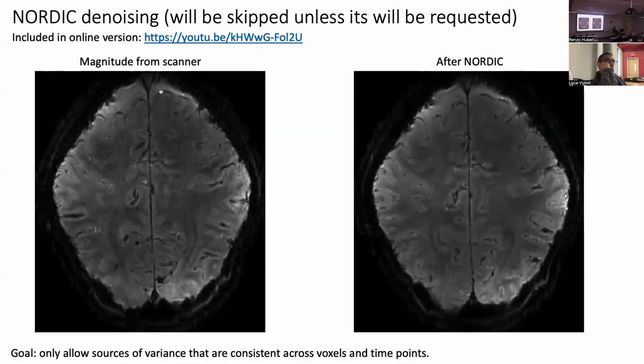Nordic is the first step that is included in the online version of this tutorial that I recorded last week. So if you will not get to it tomorrow, you can check it online. It's basically converting data time series that look like that into data time series that look like that. And I'm not sure how that comes across nicely.